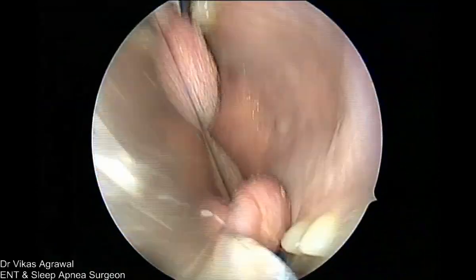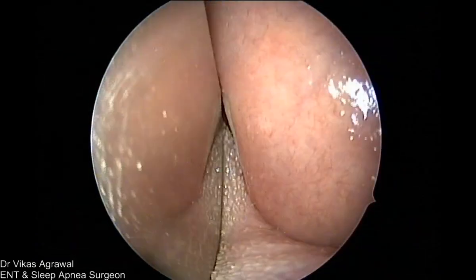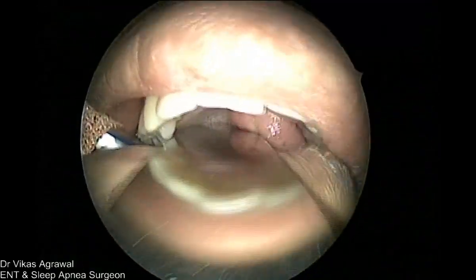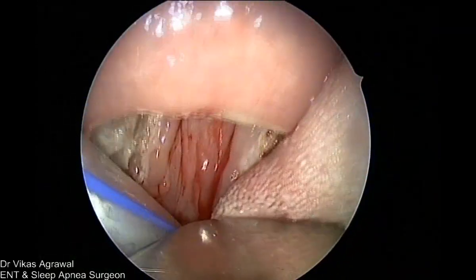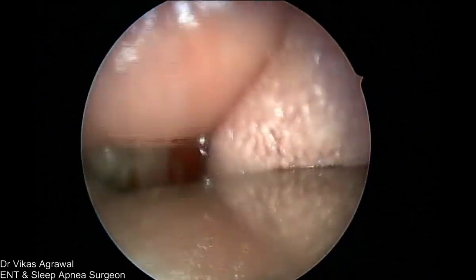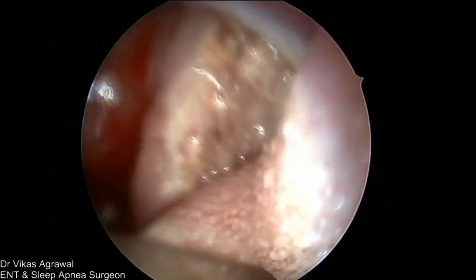Move away from the front. Camera rotated. Okay. See, this was the area operated, the area operated on the left side. Both these areas are not clean.